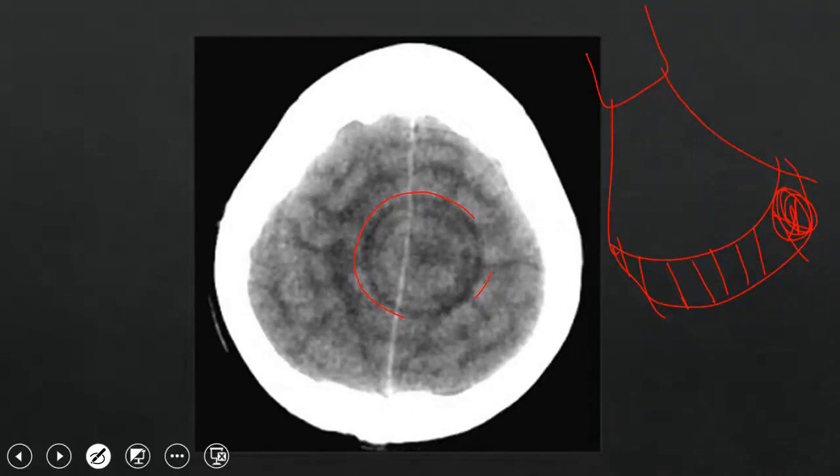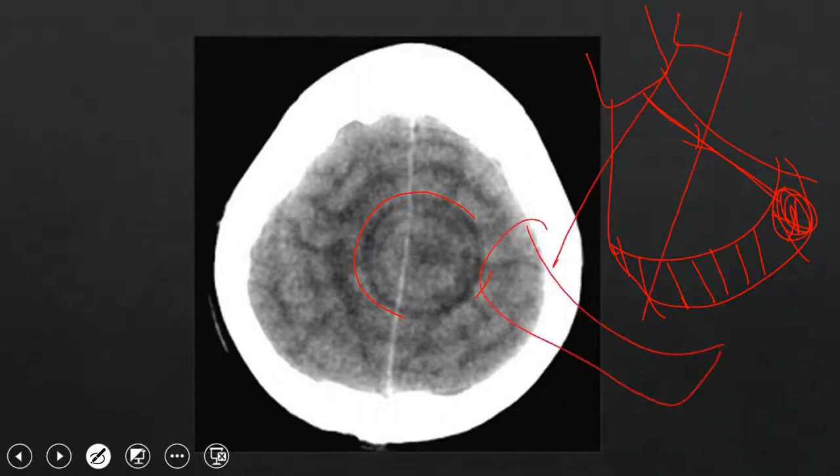So what happens? You start taking projections, and this area is not recorded. Then it starts taking new angles, and the detector remains defective. So this part becomes not recorded. So in the end, when the tube rotates in a circular shape around the organ, you start to see this ring.